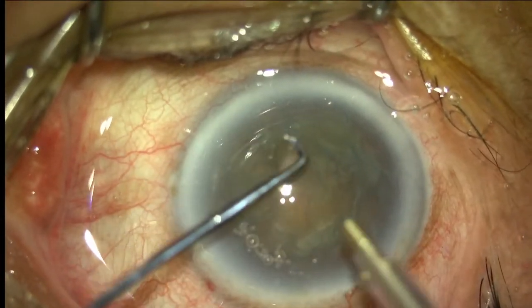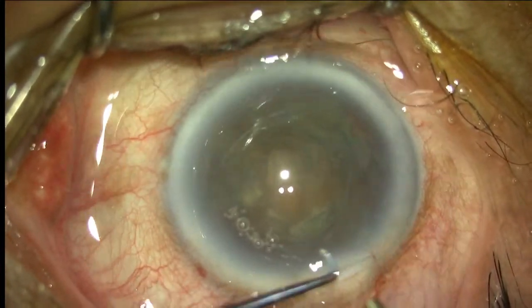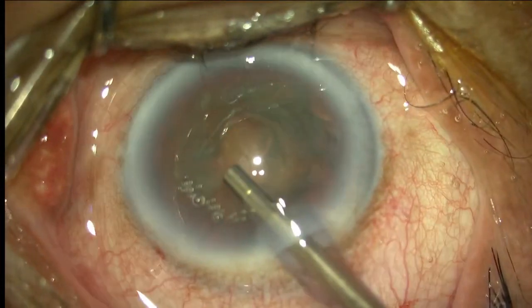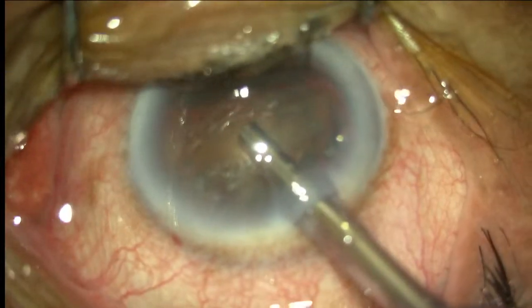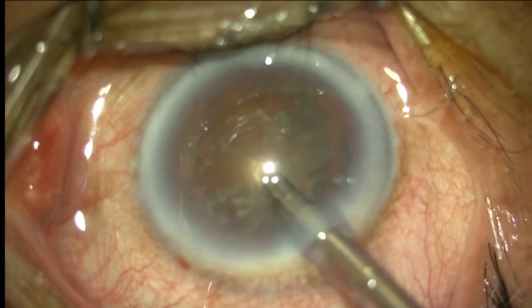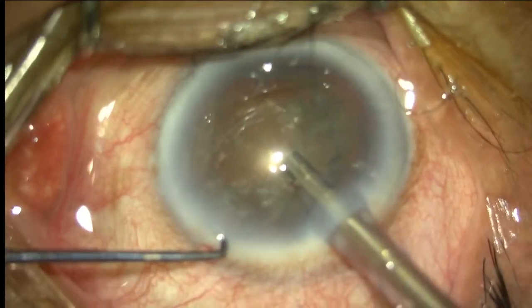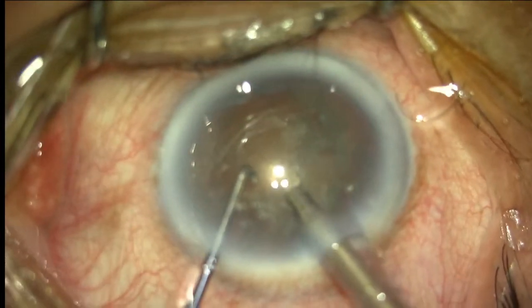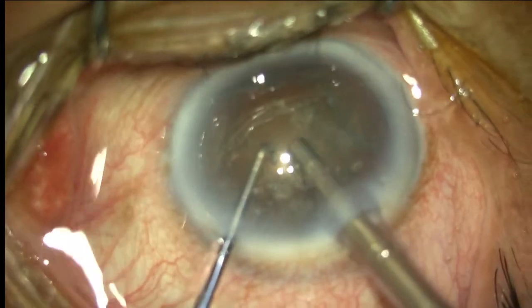And this is the chopper I'm going to use. This is a Terminator, a specially designed chopper for this kind of cataract. So I'll be just cleaning some of the socket. I've gone to the chop setting now, and I use vacuum around 470, 480, and fluidics flow rate around 34.